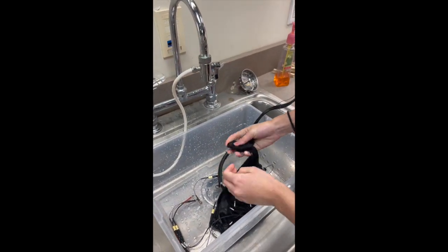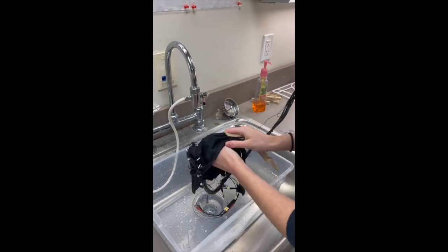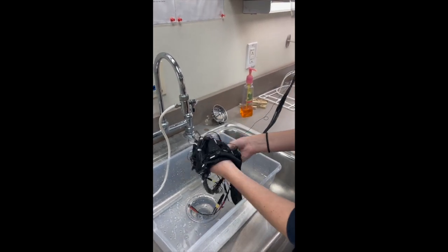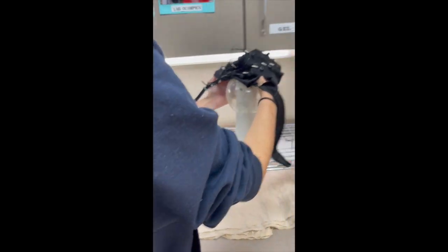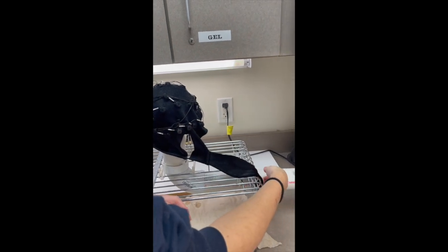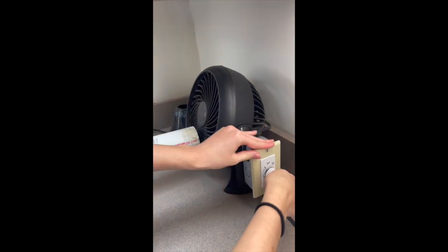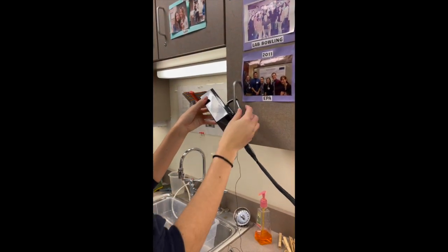After the three minutes are up, keep the cap in the wash tub and rinse it under hot water. Then squeeze the chin strap to remove as much water as possible, and gently pat the cap and chin strap dry with paper towels. After you're done drying, take it over to the drying rack and carefully transfer the cap from the wash tub to the dryer, putting your hand under the cap to support it. Then set the timer for an hour and a half.